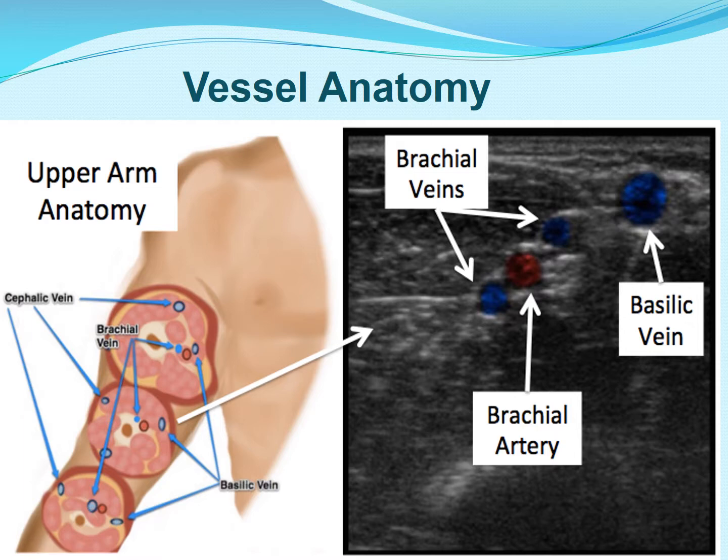The vessel anatomy. The cephalic vein, the brachial vein, and the basilic vein are the three deeper veins usually noticed and seen on the patient's arm. Your gold standard vein for inserting a catheter, such as a PICC line, peripherally inserted central catheter, will be the basilic vein. The cephalic vein is very difficult to see in some patients. It's not always predominant. The brachial vein is very close to your arterial structure, so that's your second go-to structure when you want to have venous cannulation.